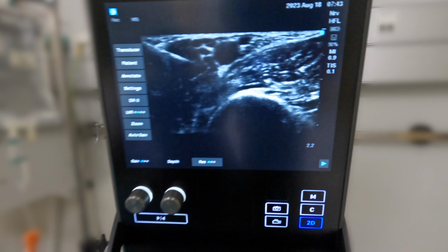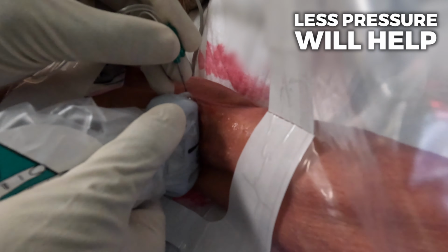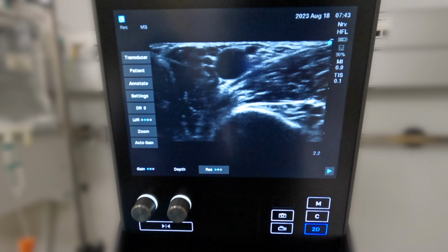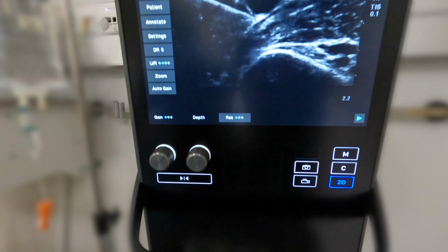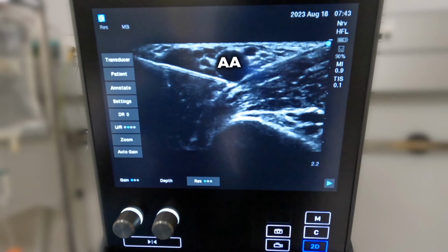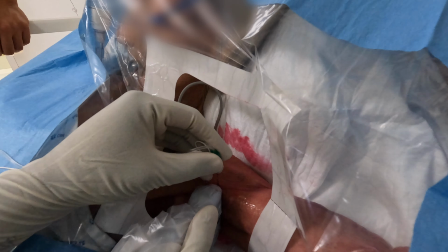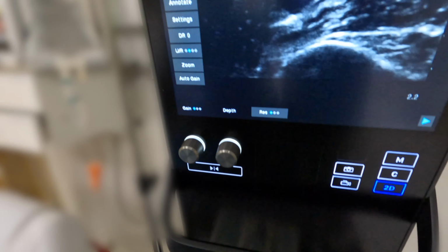What will help you here is less pressure. If you have pressure, unload the pressure, it will help you open the space where the needle needs to pass. You see how skinny patients could make it a lot more difficult because you don't have adipose tissue to lift it up. You want to scrape the adventitia of the axillary artery to avoid the artery. Aspiration negative. Let's see what the first injection of 1 milliliter of local anesthetic will do.